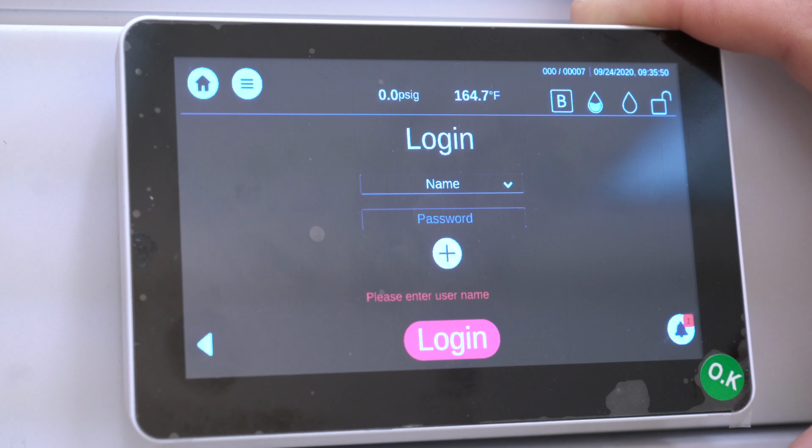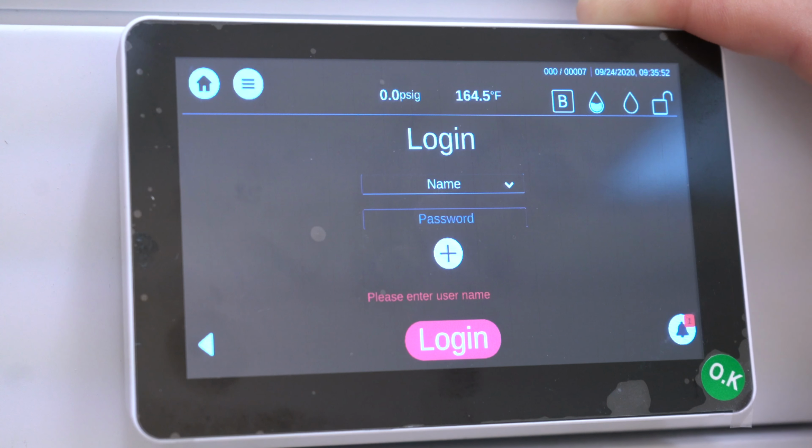This is important when we're going to print labels. When we print labels, that information, the tech, will actually be on the barcode. And that barcode will tell us the tech, the date, the time, the sterilization cycle parameters, and if it passed or failed. So it's really important in ambulatory surgical centers and hospitals, if they're going to track packs throughout their system, that you'll be able to set that up as well.